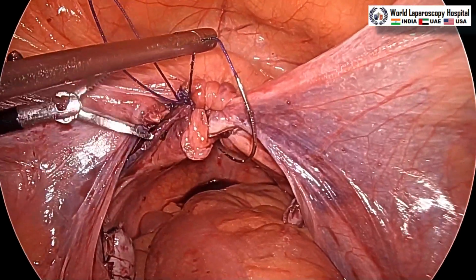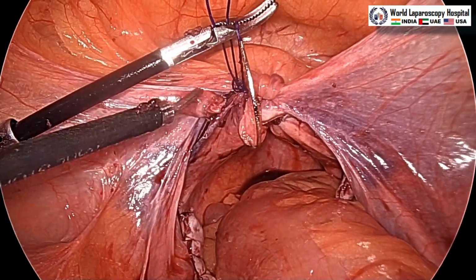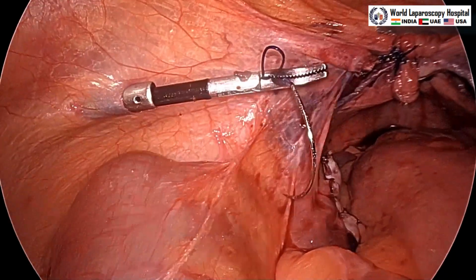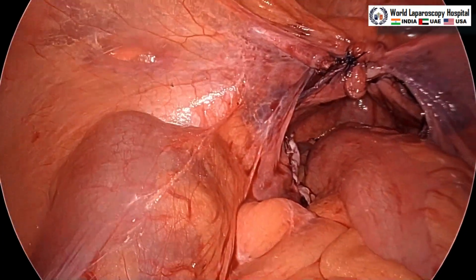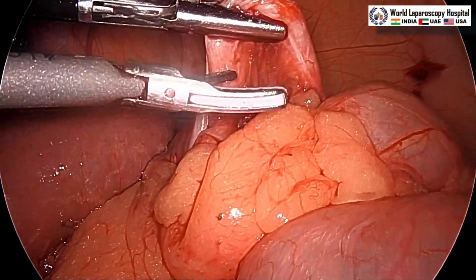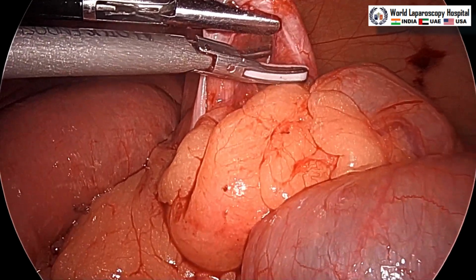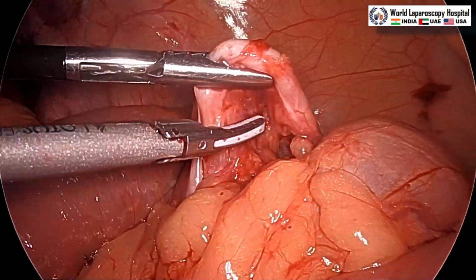So, this is the suspension part of the surgery. And it is done. After that we will cut the suture, and then first take the needle out, and then we will perform the appendectomy part of the surgery. With the same port, however, it is not ergonomically correct. We can see this is a retrocecal appendix, the tip of the appendix was not visible. So, we will start from the base itself, because the tip was completely subserous and it was going retrocecal.